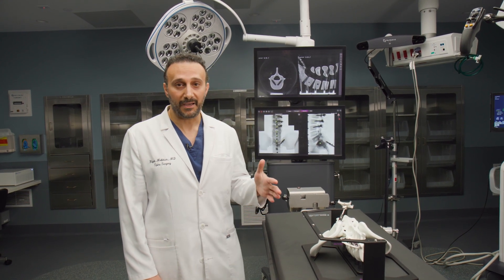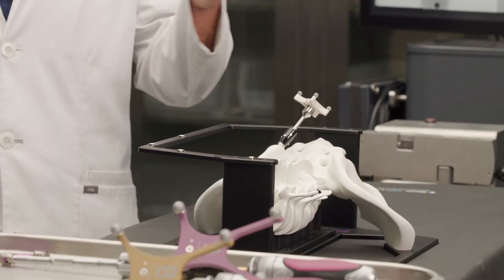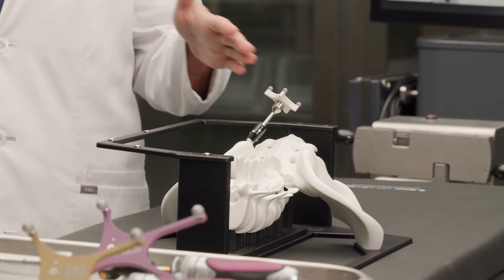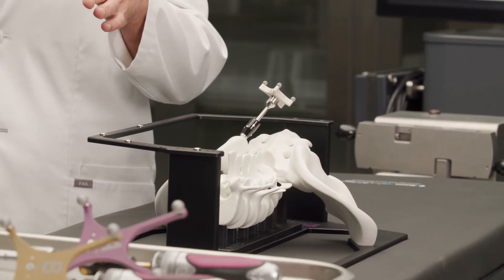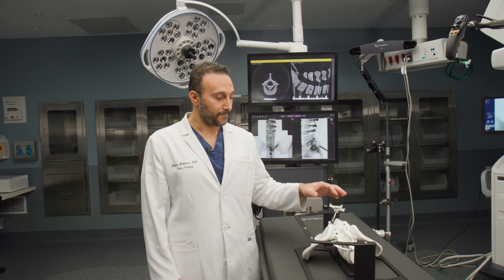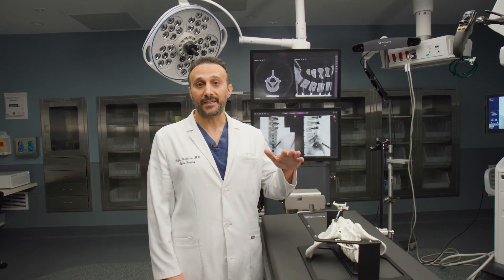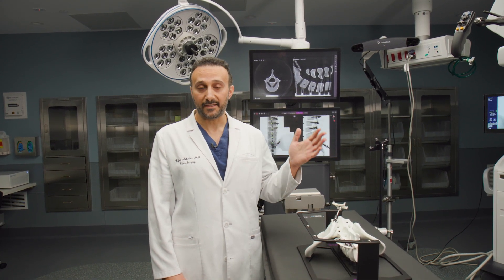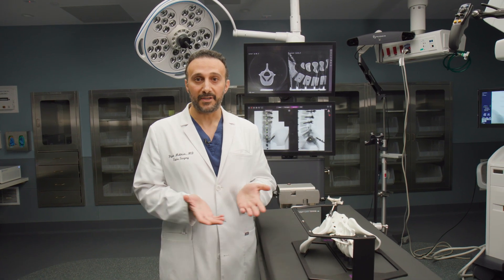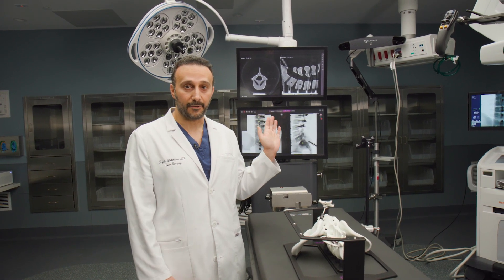The basics of how the platform works are there are reflective markers that are placed on the patient themselves and on the instruments that we're using. We'll start first by placing a reference frame on the patient and then using an x-ray to take some images that the computer will then assemble into a three-dimensional model, which you can see behind me here.